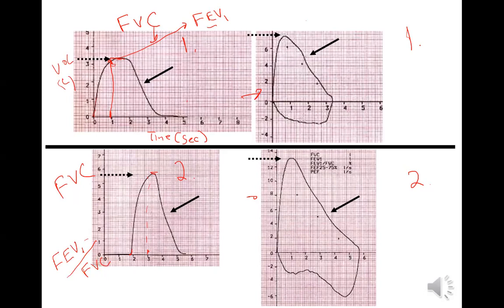And this is really all exhalation, testing for COPD, for obstructive conditions like emphysema, chronic bronchitis, or asthma, right? So now this one on this side, this is a flow volume loop. Now this one is going to come out, or a diagram, or whatever Dr. Lee is going to call this, but it's flow and volume. So the machine will take the FVC and convert it to this chart. So again, all you have to do is know what this is. It's a flow volume loop that's based on the FVC.